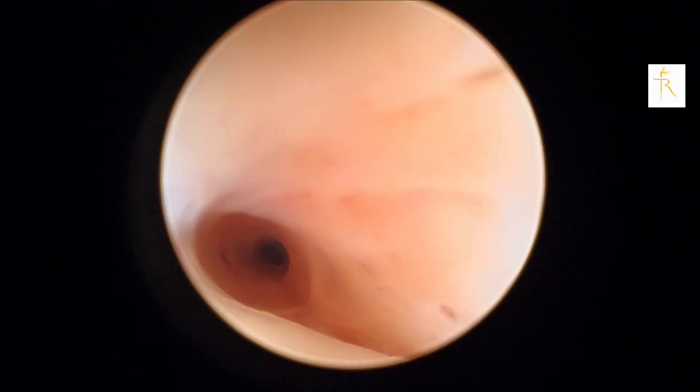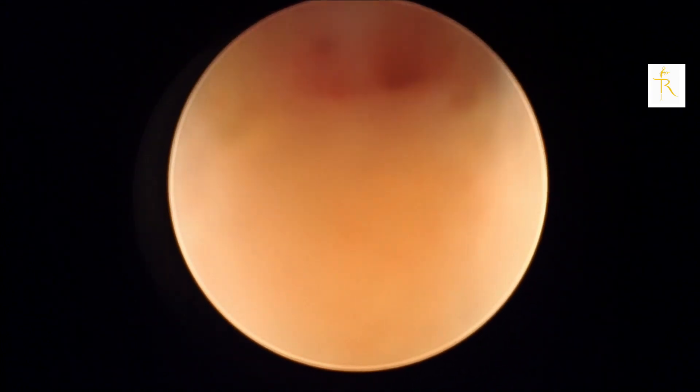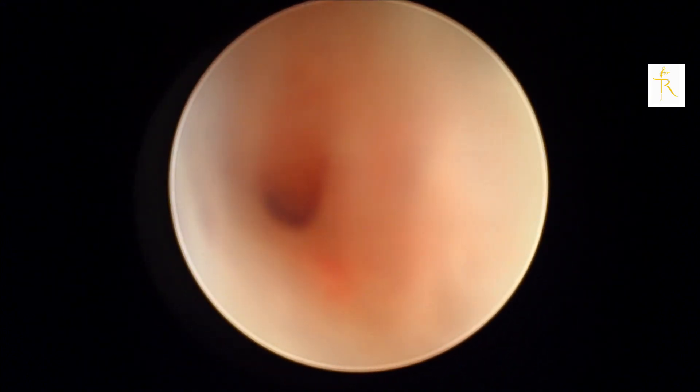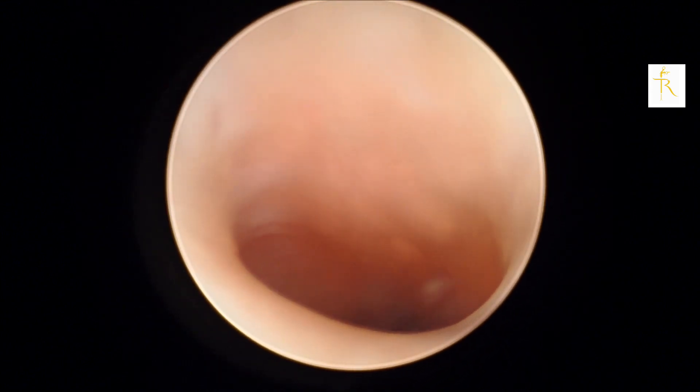You can see there are two holes on the right and left with a septum in between, probably because of menopause. We're trying to negotiate with hydrodilation, persisting on one side — and there you have it.